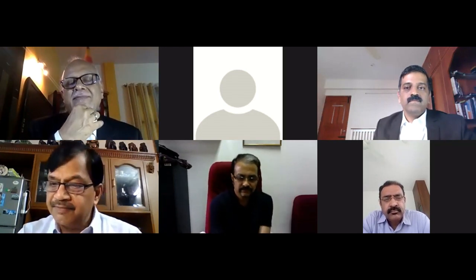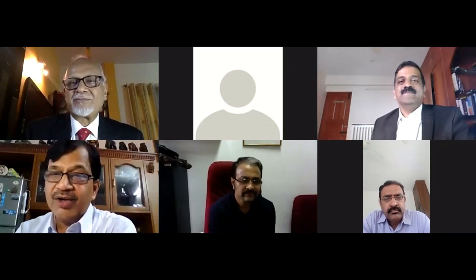Thank you, Ullas. We have two very quick questions for Dr. Prabhakar Koregol. If you are going to miss 2 out of 3 MIs on ECG, then how are you going to pick up those 2 that we are missing? This is a question asked by Dr. Suresh KS.